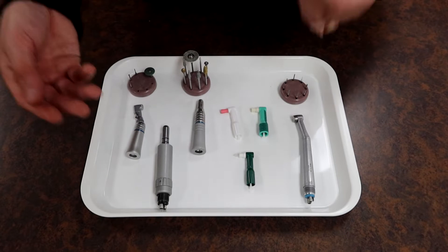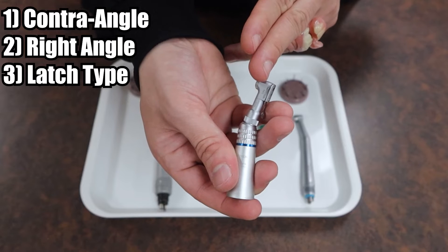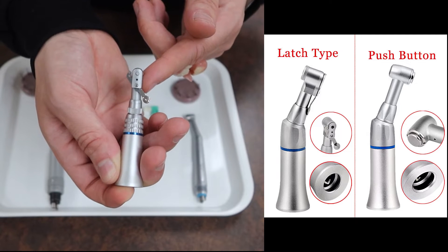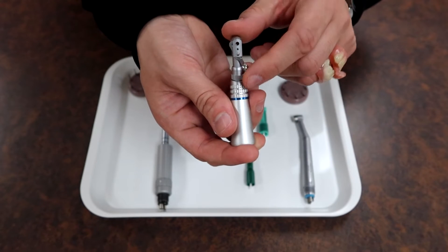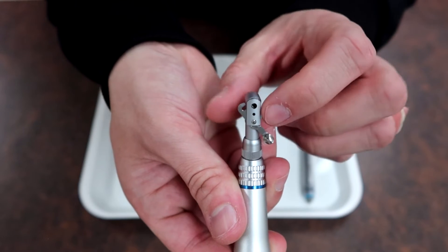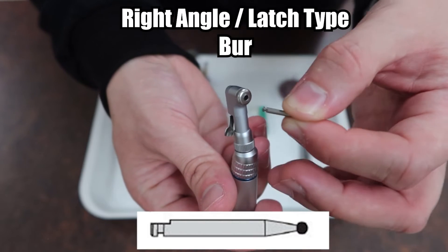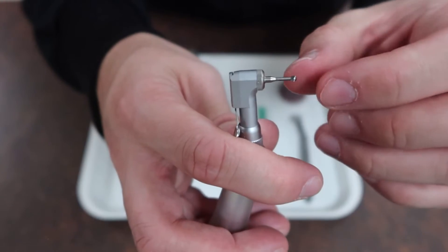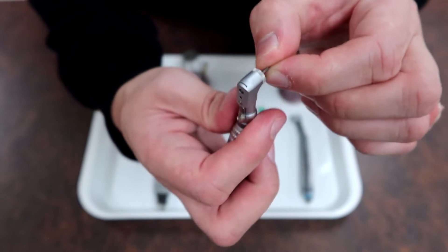With our slow speed motor we have attachments on the left and right that perform different duties. This first one has a couple of names: it can be known as a contra angle, a right angle, or a latch type, because of the special latch mechanism on the back — which could also be replaced with a push button — to insert and remove burs. The latch or push button in the rear opens to accept a bur. You're looking for a bur that has a notch in the end; insert it and slowly turn until it drops into place.